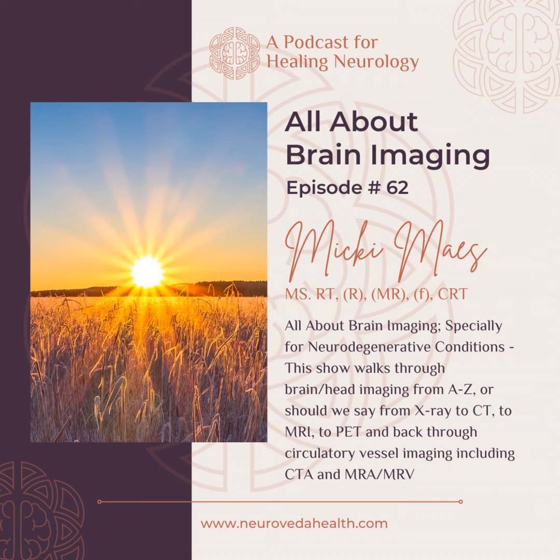But when we do MRI, specifically for NeuroQuant and other studies for neurodegeneration, we use something called 3D imaging. So you've hit on something really important here. In a volumetric scan, we're doing one of those scans within the MR protocol that we call volumetric and/or 3D. What that allows us to do is reformat all of the data that we've got into a 3D model. So now we can look at the brain structures and remodel them into a 3D anatomic visual, so we can look at it from all different planes.